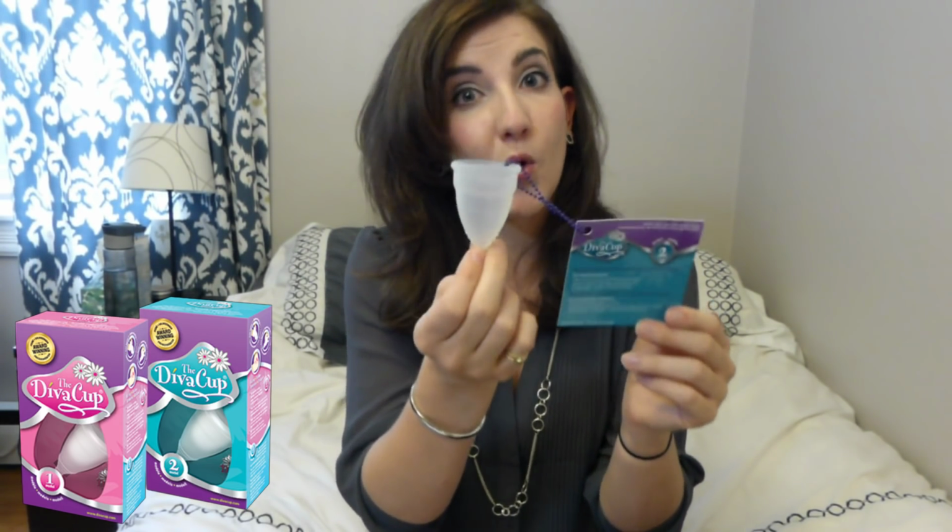The Diva Cup makes 2 sizes of cups. So as you can see, one is slightly bigger than the other. The smaller one is otherwise known as Model 1. This is for women who are less than 30 years old and who have never delivered a child vaginally or by C-section. Model number 2 is therefore for women over the age of 30 or those who have delivered children either vaginally or by C-section.